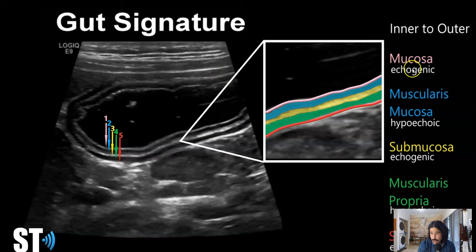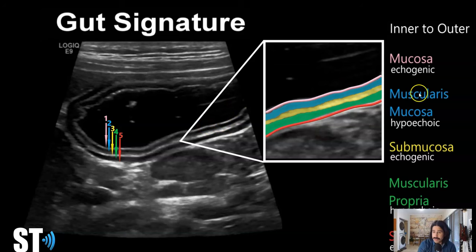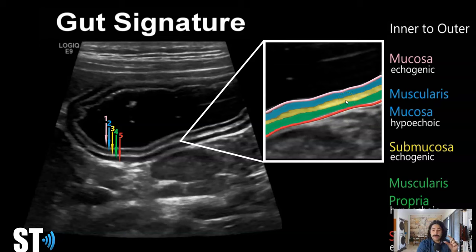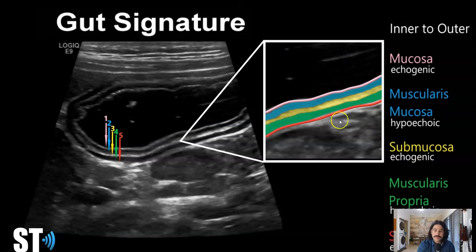The inner layer is the mucosa, which is the echogenic layer. Then a darker hypoechoic layer is the muscularis mucosa. Then the echogenic middle layer — the submucosa — which I remember because when there's bowel wall thickening, that one tends to predominate and gets real thick. Then the muscularis propria, which is hypoechoic. And finally the serosa or outer layer, which is also echogenic.